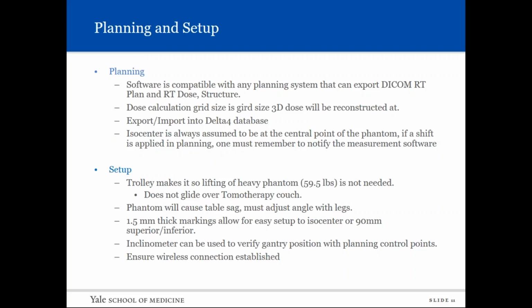A couple little notes when you're planning. Whatever your dose calculation grid size is in your planning system, that is the grid size that 3D dose will be reconstructed at in the Delta4 Phantom.